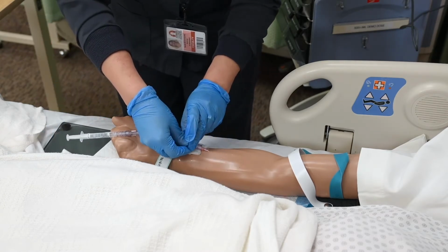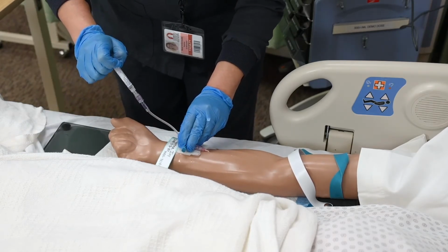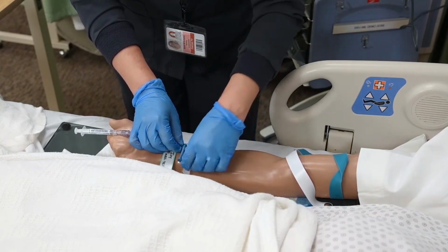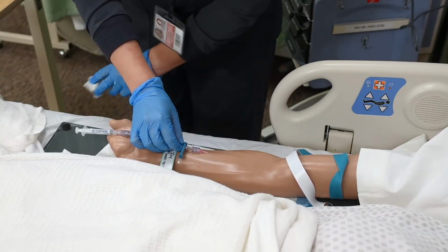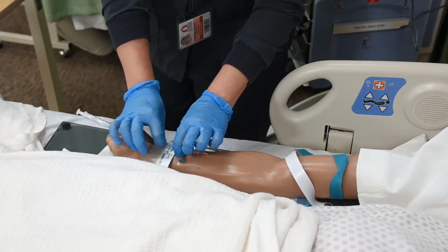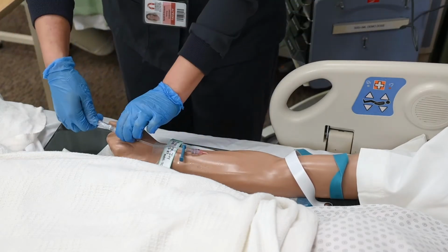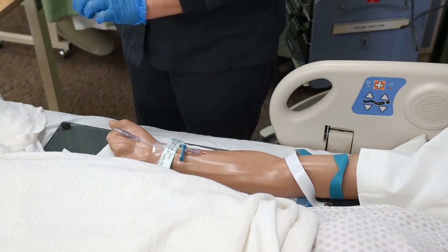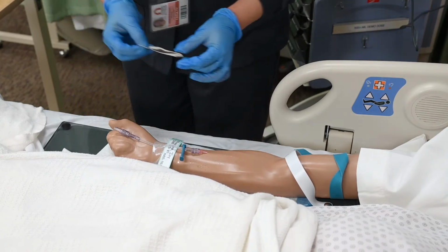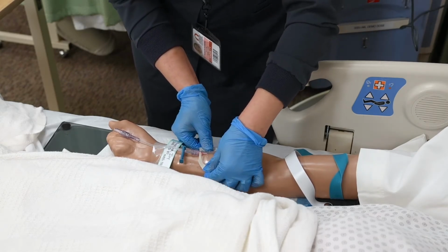Remove the 2x2 gauze dressing and clean around the site without contamination. Apply tape to the extension set or INT to stabilize the catheter. You can now let go of the catheter. Apply transparent dressing over the insertion site, maintaining sterility of the site. Be sure to cover the hub of the IV catheter, but not the extension set.